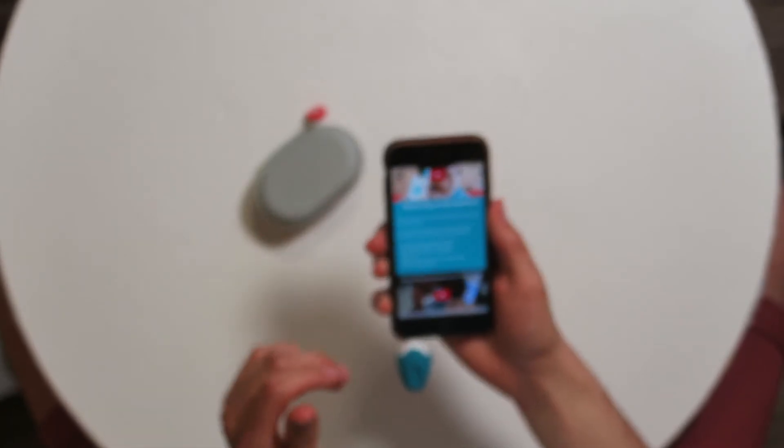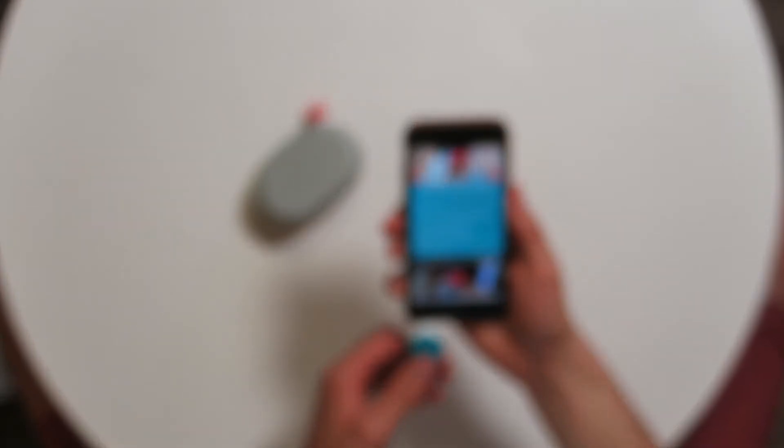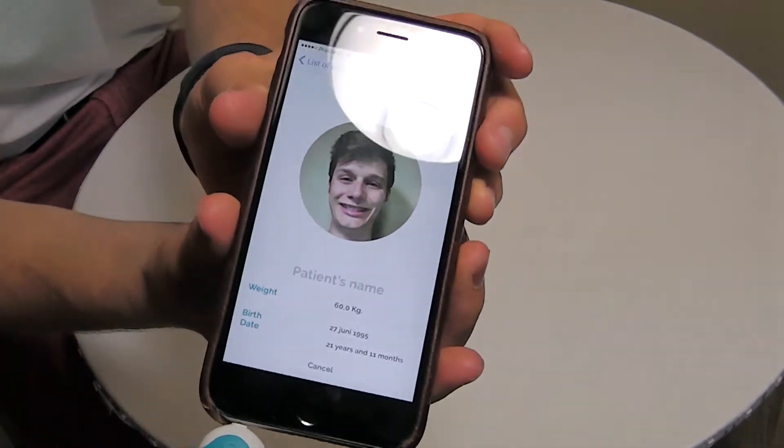The app gives instructions via video and text on how to measure on the forehead. For a correct measurement, make small circles on the temple. It also notes circumstances where forehead measurement is not recommended. Here's the measurement screen.